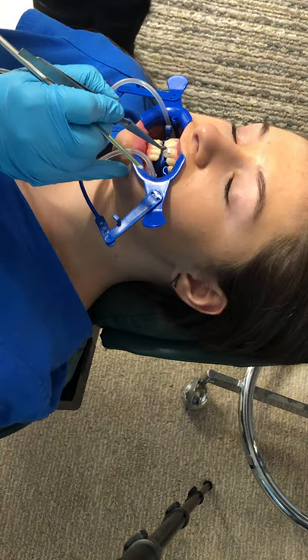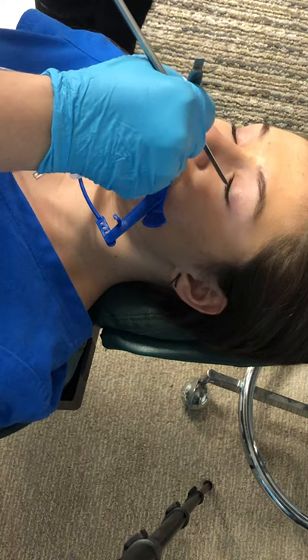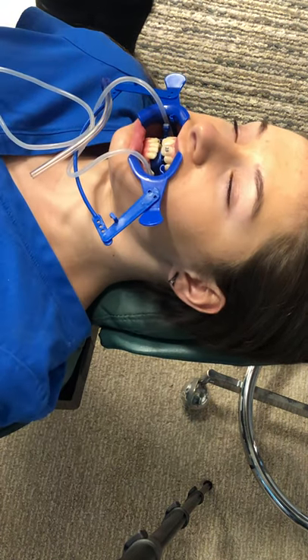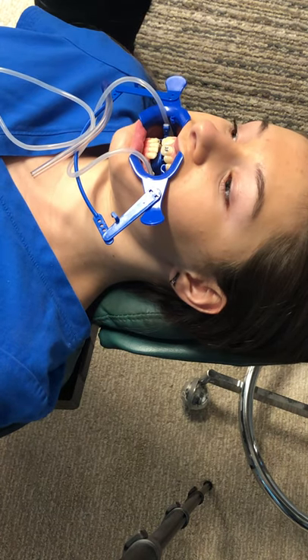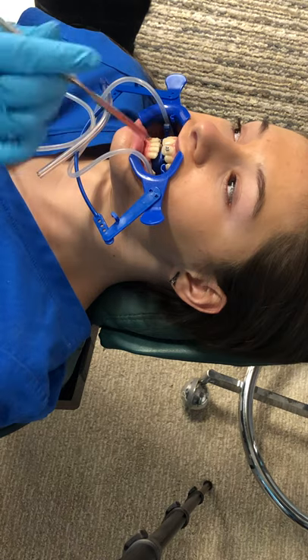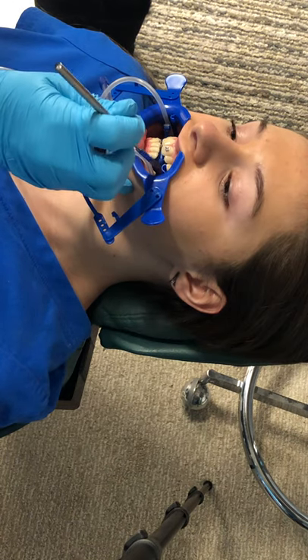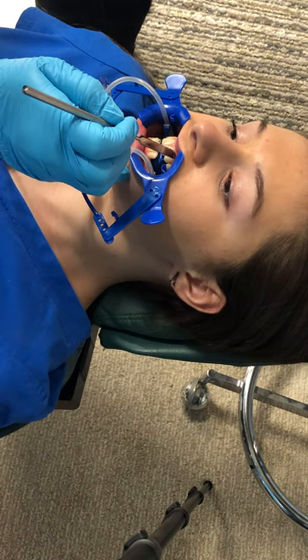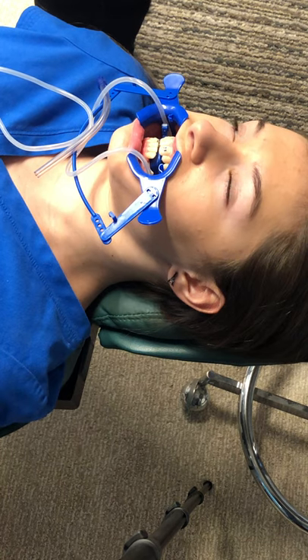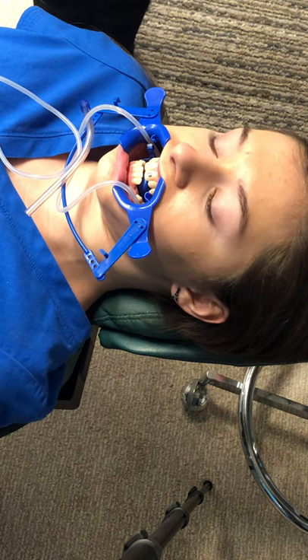There's an identification dot that should point distal-gingival. When I look at that, there's the red dot — I have it upside down. That identification dot tells you where it needs to be. Here's your midline, and every tooth on this side the back part is the distal. The gum is gingival — it always points distal-gingival.